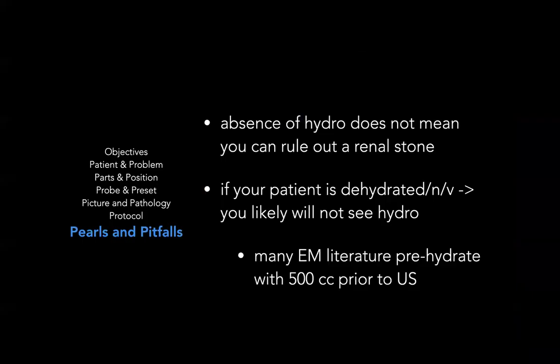Now, when looking for hydronephrosis, the absence of hydronephrosis does not necessarily mean you can rule out a renal stone. It just could mean that the stone was not severe enough to cause hydronephrosis. Another pitfall is that, in the emergency room, potentially even urgent care setting, if your patient is very dehydrated, nauseous, vomiting, hydronephrosis may not be easily seen.